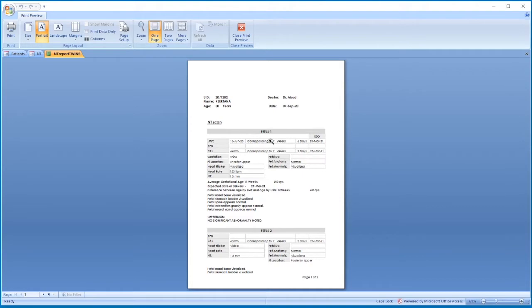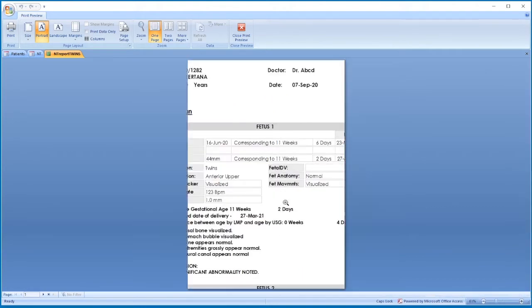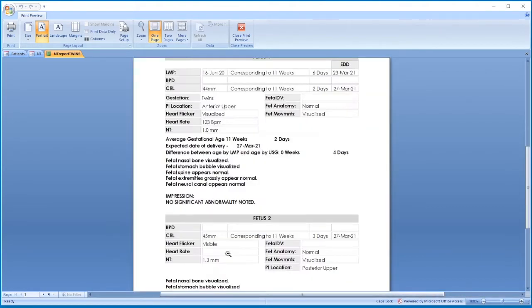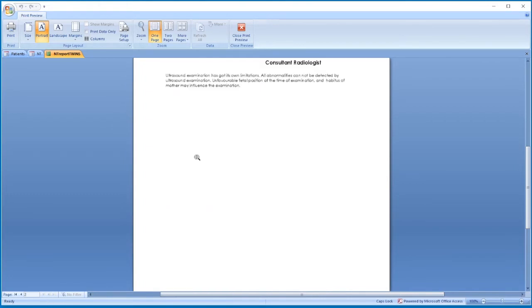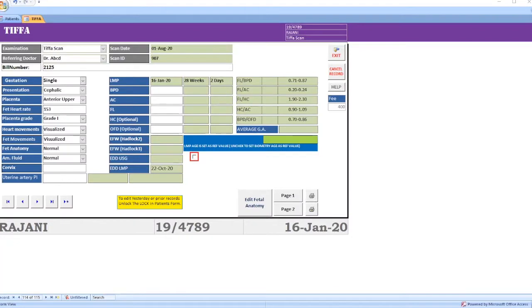If it is a twin pregnancy at 11 to 14 weeks, the report will show fetus 1 details and fetus 2 details. This is the complete report. This is the TIFFA form — again there are different options: single, twin, and triplets.